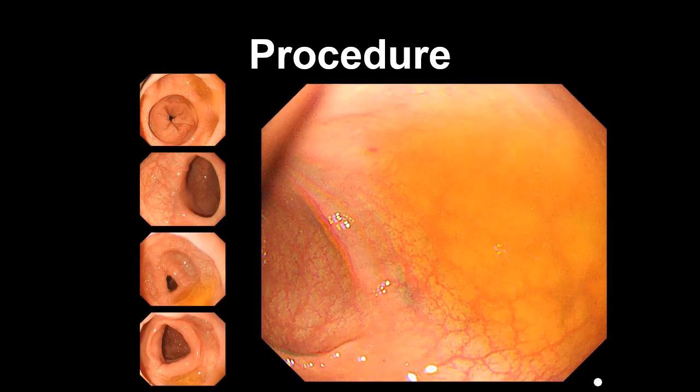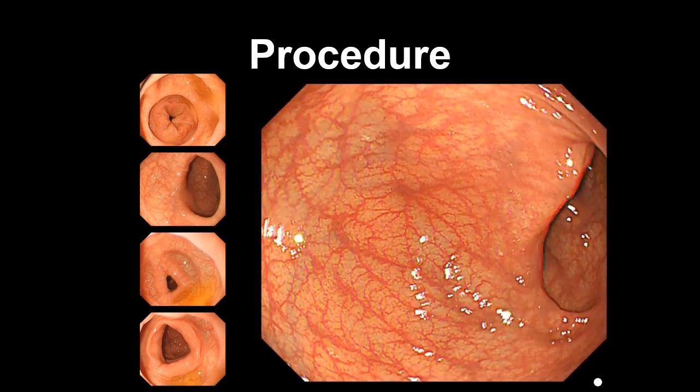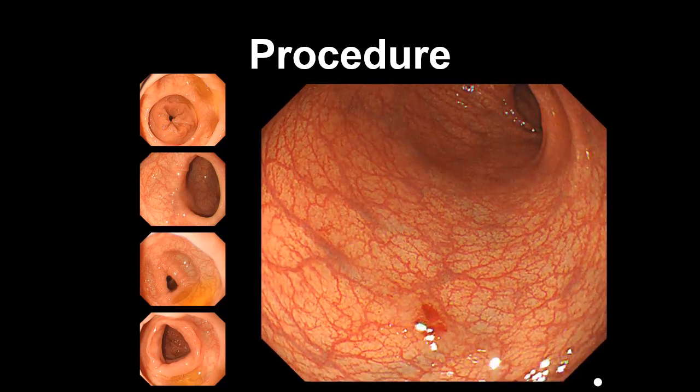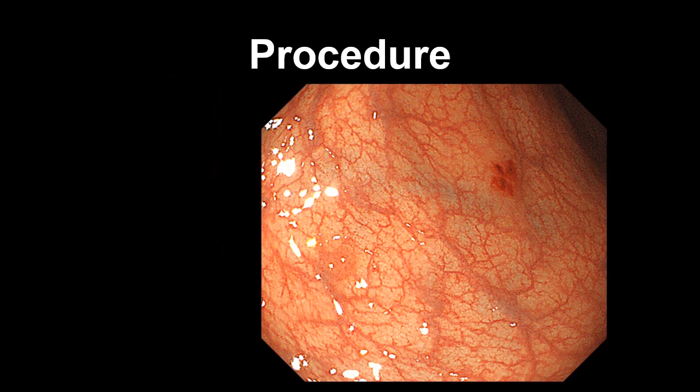Subsequent to cecal intubation, we searched for the marked polyp as we withdrew the scope. This video demonstrates clearly that the suction mark is more prominent than the polyp, and assists with the re-detection of the lesions detected during the insertion phase.